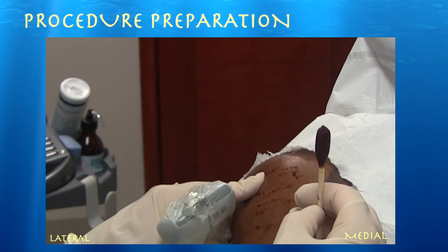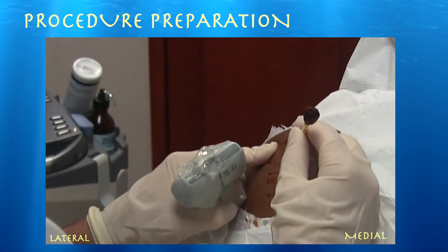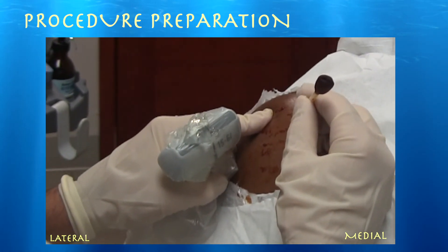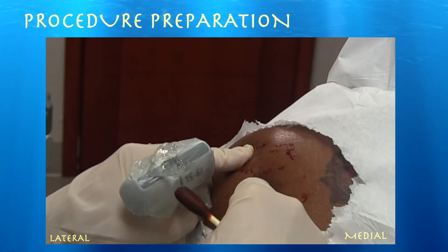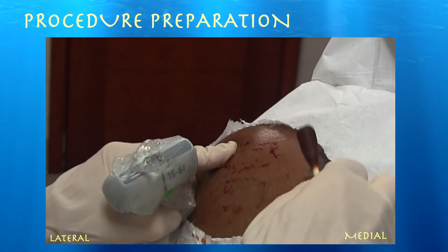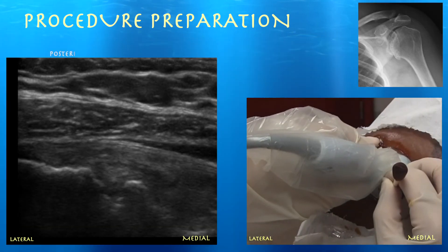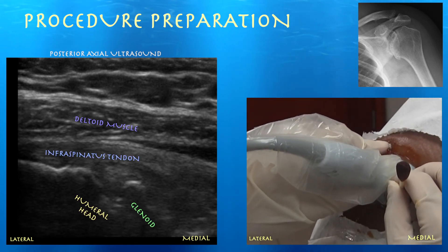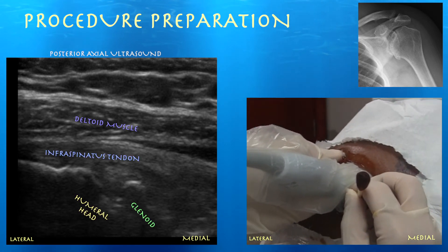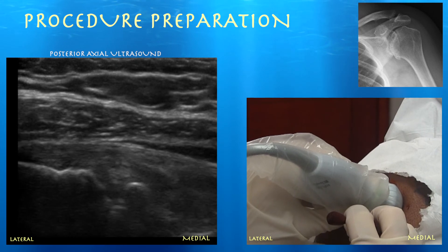This is our patient for her second injection — she did well from the first one. Here's her posterolateral acromion; you go down a centimeter and over and that's usually your soft spot. The right side of the screen is medial, the left side is lateral. You can see her humeral head, which is irregular from osteoarthritis. Here are the structures: humeral head, glenoid, infraspinatus tendon, and above that the deltoid muscle.